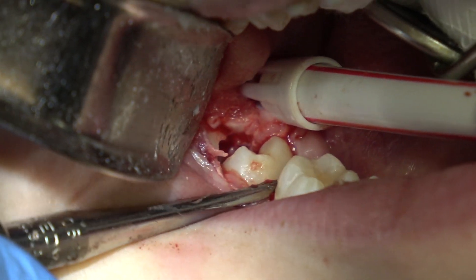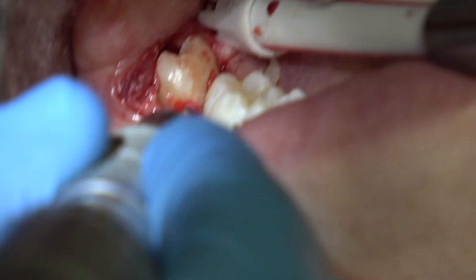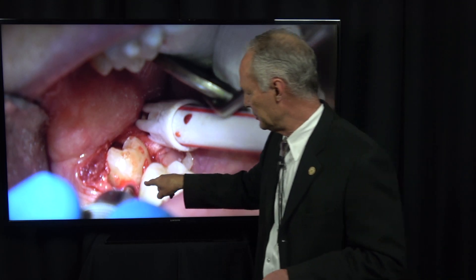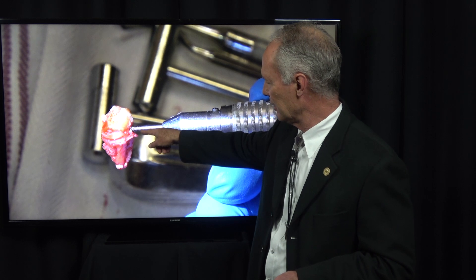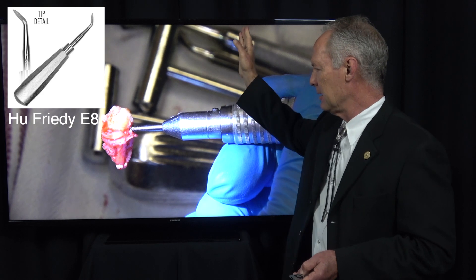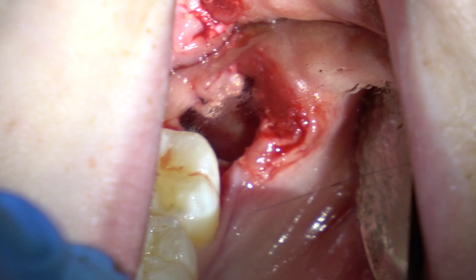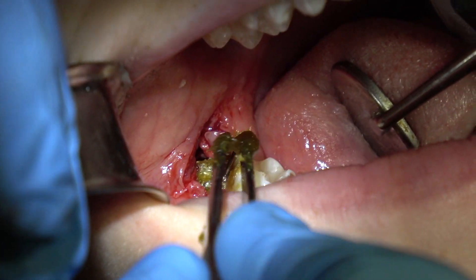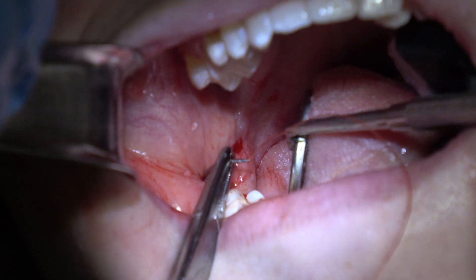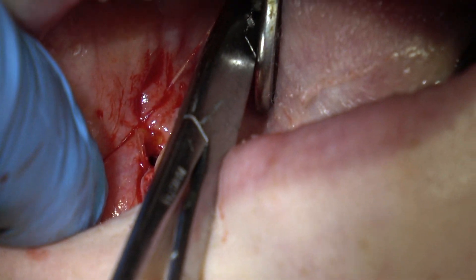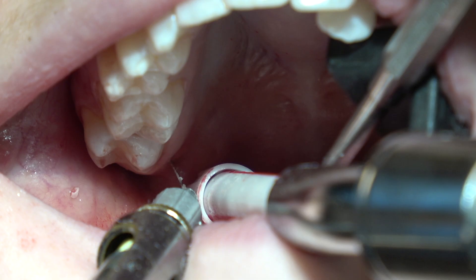Sometimes they come out in pieces. I'm elevating the mesial part of the tooth and creating a little space — you've got to have space to elevate into. Using a straight shank surgical bur to drill a hole into the mesial half of the tooth, then using this pointed elevator in the hole to lift that piece out. Go back in and remove the follicular sac. Placing the resorbable gauze with the medicated gel, then two 3-0 gut sutures — one just distal to the second molar and one distal to that. Close it nice and tight to control bleeding and form a nice clot.